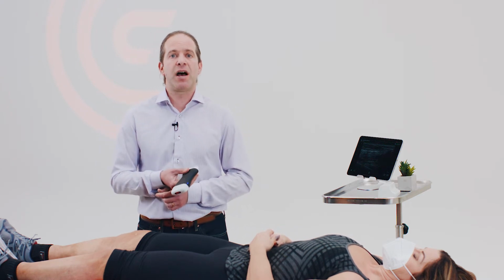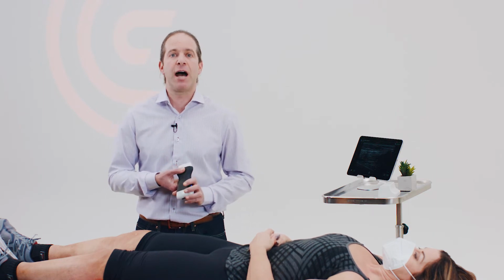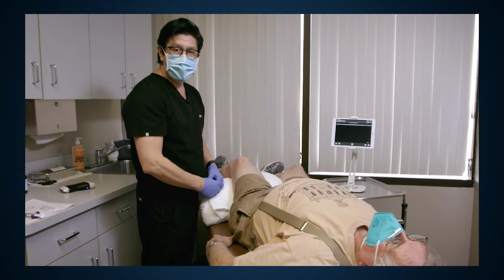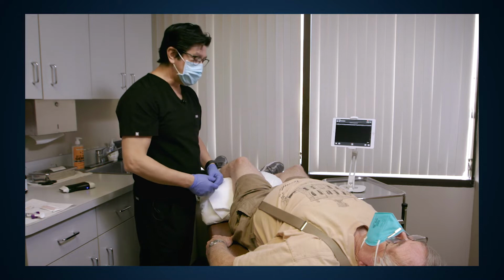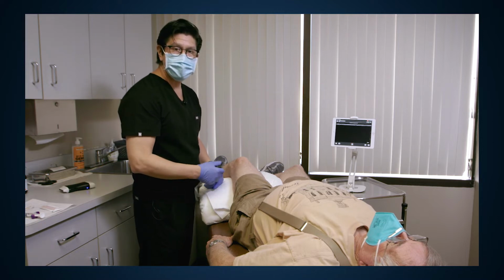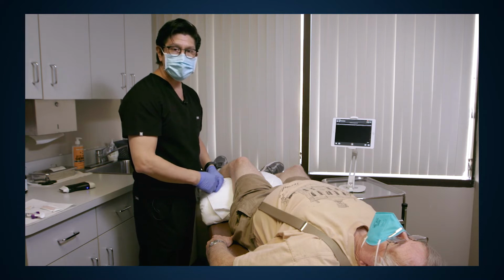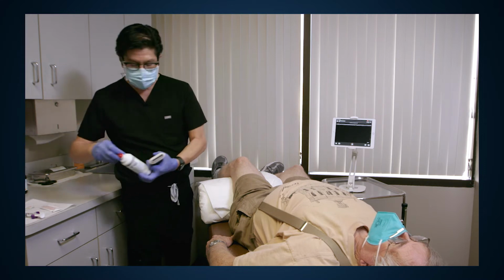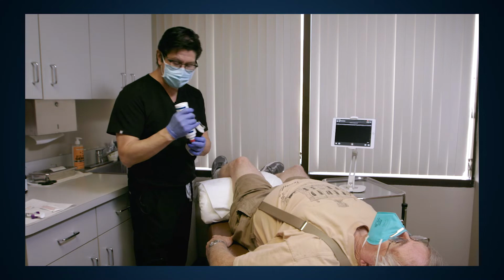Let's see how this is done by Dr. Alan Hirahara, who's board certified in both orthopedic surgery and orthopedic sports medicine, but he also holds a black belt in ultrasound-guided procedures. Hi, I'm Alan Hirahara. We're going to be doing an injection using ultrasound. We'll be doing an injection of hyaluronic acid into this left knee for a male who has degenerative joint disease and is trying to get some relief from some of this lubricant. So we'll be doing this under ultrasound guidance using this Clarius device, L15.